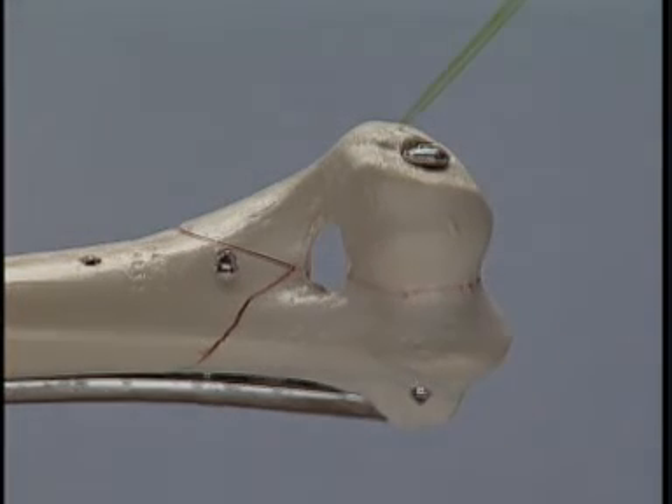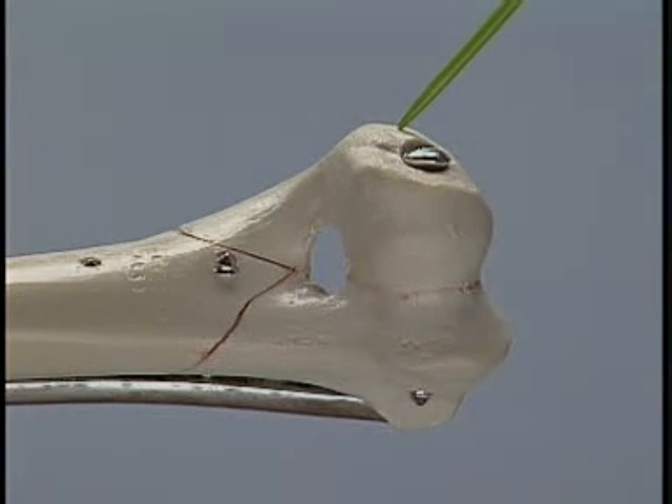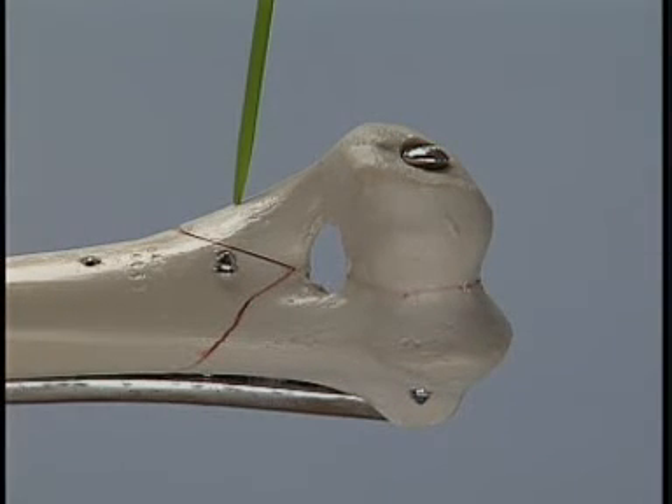As shown by the green pointer, an intramedullary pin can be inserted in a lateral to medial direction. This will provide two points of fixation to the lateral fragment. It may also be possible in some fractures to fix the lateral fragment with a second lag screw, eliminating the need for the intramedullary pin.